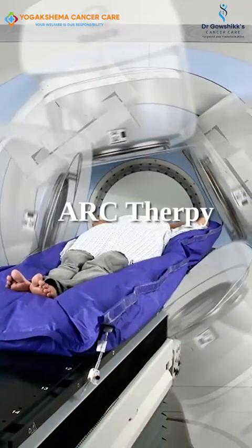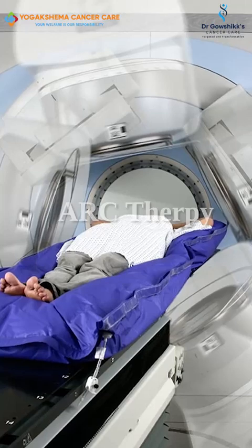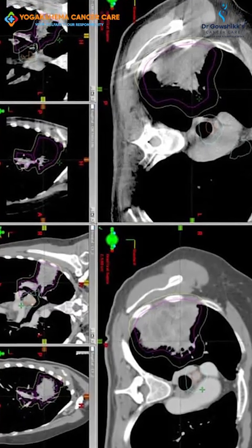Then comes the arc therapy. Arc therapy is basically volumetric modulated arc therapy. In this technique, the machine takes one complete circle, a complete arc. That's the reason arc is included in the name. Through this, the tumor gets treated in a very, very precise format, with very minimal dose falling on the surrounding structures. Instead of giving an example, I can just give a clinical scenario for that.